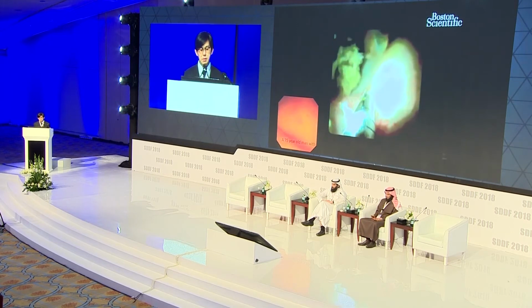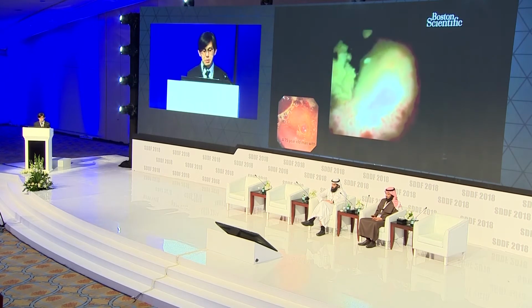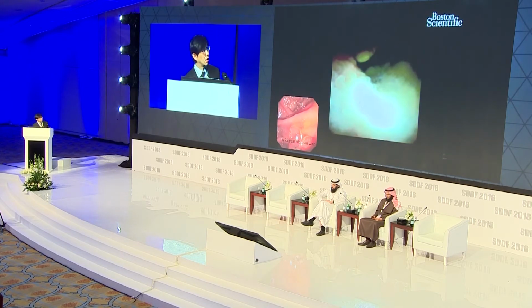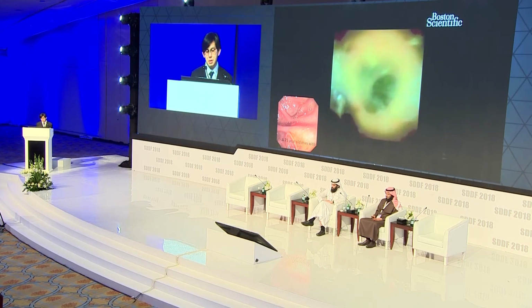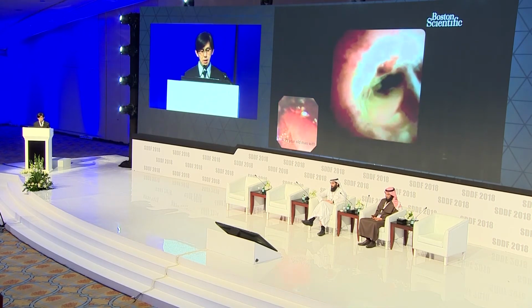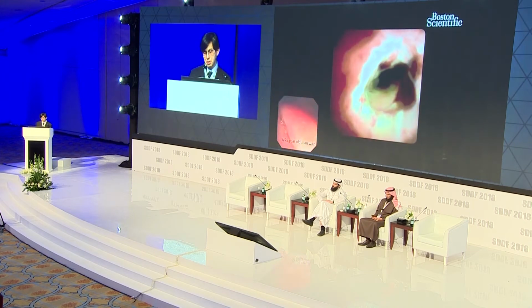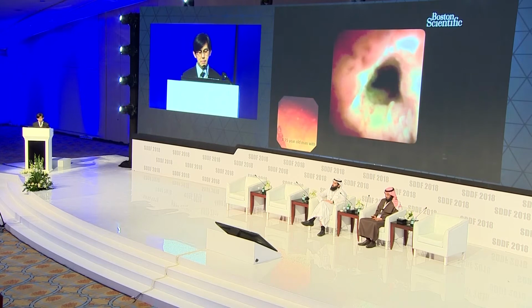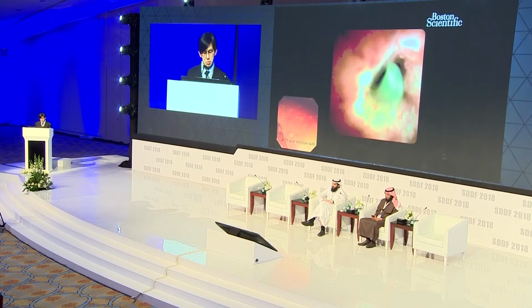And this is a very typical fish scale appearance, and the other feature is the Clonorchis that you see, very common in China, southern China and Hong Kong. That is Clonorchis infestation associated with cholangiocarcinoma, and you can see the neovascularization that is typical of neoplastic strictures.